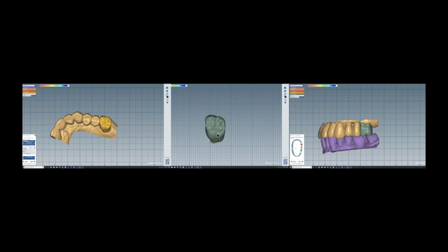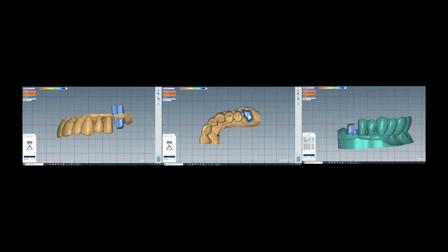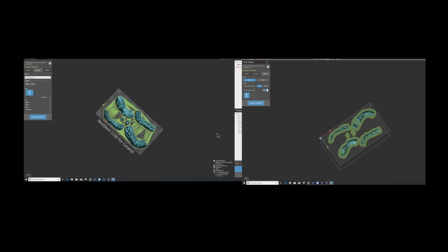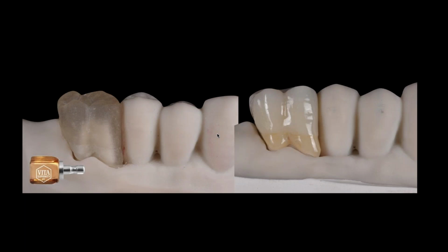Does the patient show that they have a wide smile? Do they see a lot to the back of the mouth, or is there something that you're not seeing as much and we're just really looking for more of the hardness or strength, or is there some functional component? And in our strategy, obviously, we'll lump together all our materials and try to utilize that base as much as we can. We tend to stay on the flatter side, just as a point of reference.